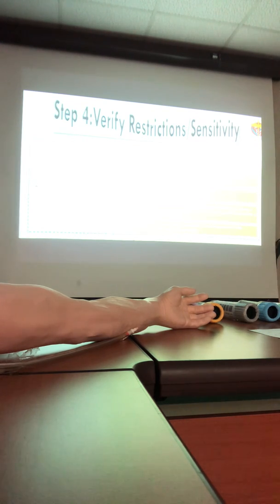Okay? If the patient has eaten and the phlebotomist is asked to proceed with the collection, it's important to write that the patient is not fasting. This is the meaning of diet restrictions. Sensitivity: some patients have allergy to latex. So we should use latex-free gloves or tourniquet, non-powder gloves.